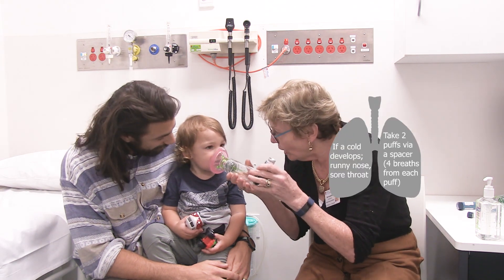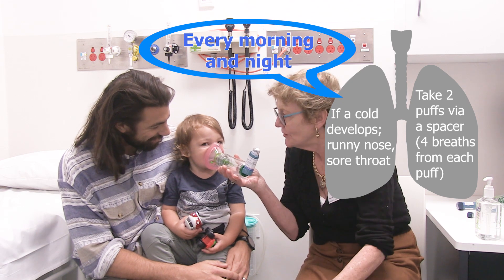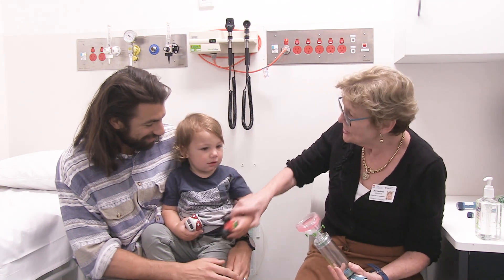Finn, can we use this? Ready? We go one and we hear the lovely sound. Two. That is so good! Champion!